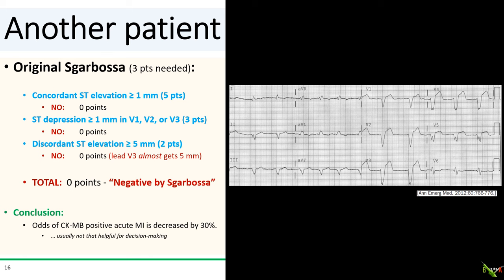Here's another patient who presented with chest pain and a left bundle branch block. Looking at the original Sgarbossa criteria, none are met: there is no concordant ST elevation anywhere, no anterior ST depression of 1 mm or more, and while there is discordant ST elevation in the anterior leads, it does not quite hit 5 mm. So this ECG is negative by the original Sgarbossa criteria, which decreases the odds of a CKMB-positive MI by only 30% — not particularly helpful for cath lab decision making.